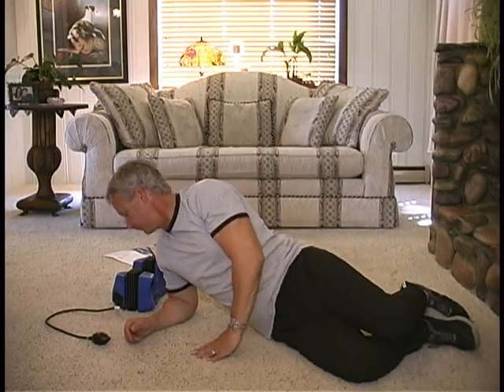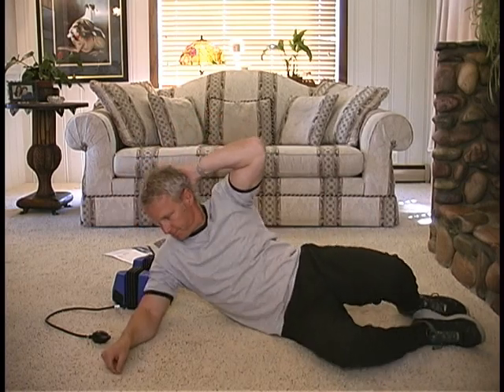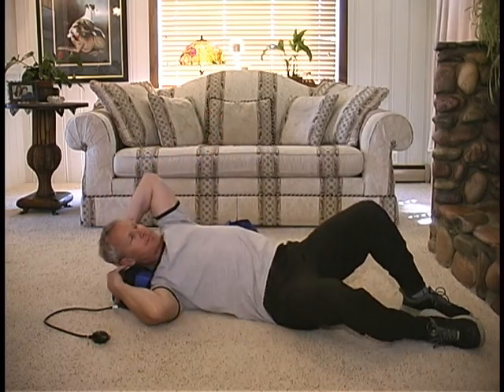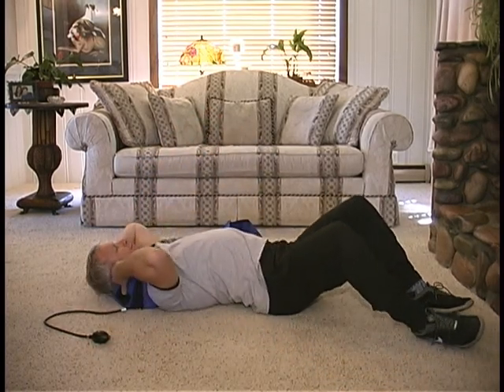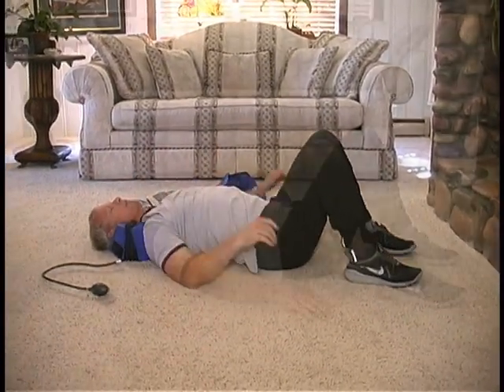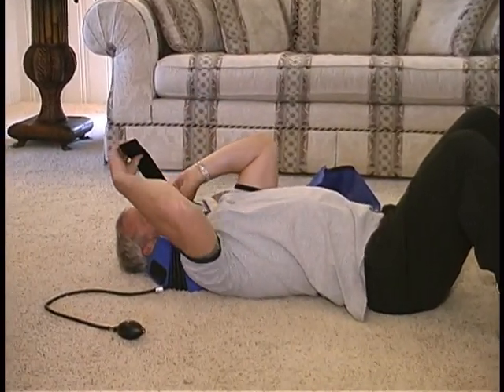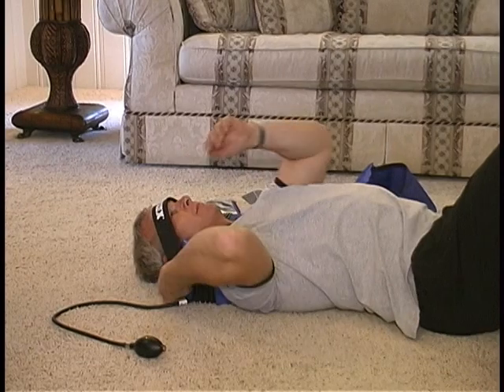Lying on one side and using one arm to support your neck and head, roll back and lay your head into the PRONEX, keeping your knees bent and your feet flat on the floor. You should always use this position. Now apply the forehead strap, fastening it to the Velcro from one side to the other.